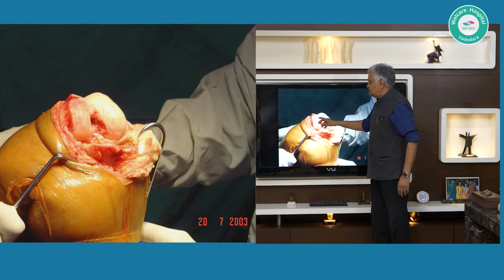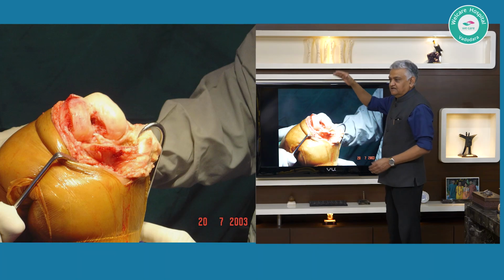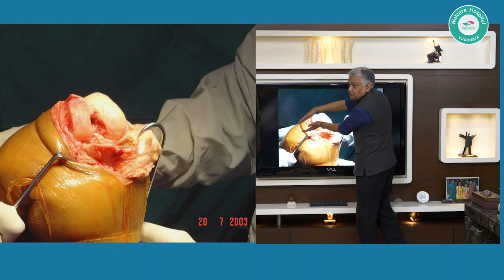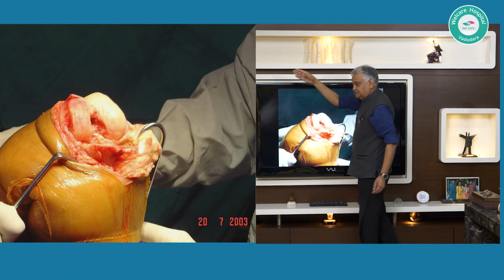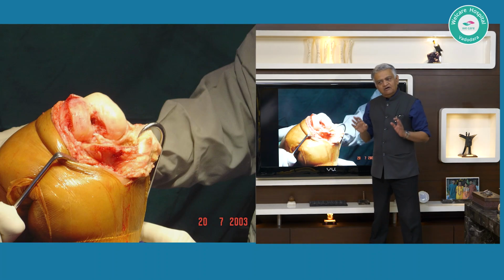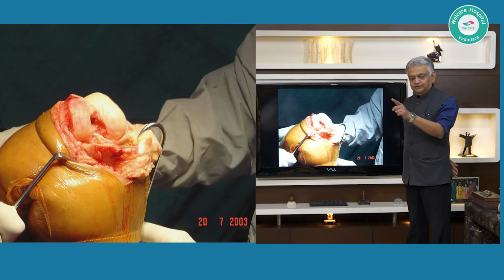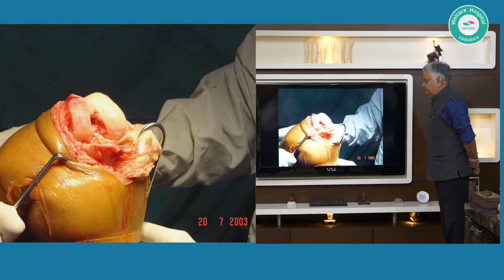So if you take it here or a little bit here, as long as you are not going outside the anterior and posterior cortices of your medullary shaft, like so, as long as it's not so anterior that you are going to go out, or it is not so angulated that you are going to penetrate it back. Yes? So irrespective of the direction of the intramedullary jig and irrespective of the entry point, as long as the intramedullary jig is inside the canal, the entry point won't matter, right? Good question.